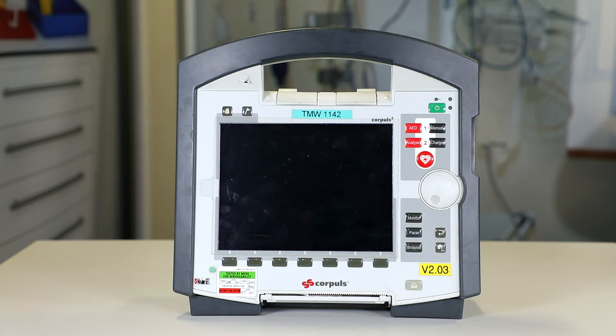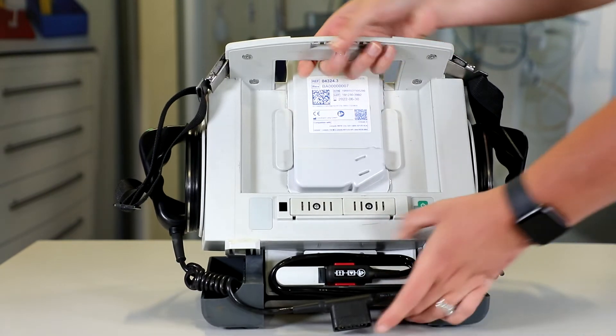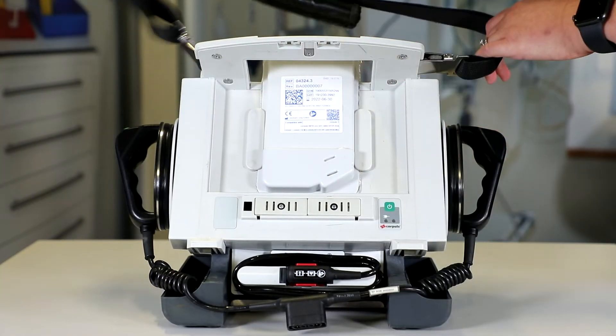The next thing we're going to look at is the physical checks for the defibrillator. As we did with the monitor, the first thing we're going to do is look for any dirt and damage, having a good look at the defib, checking there isn't anything on there such as spills, and making sure we're inspecting all parts including the handle.